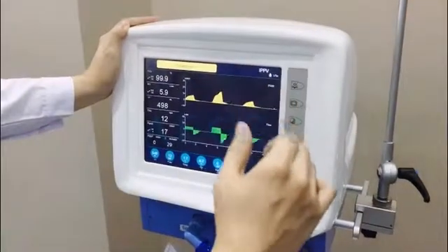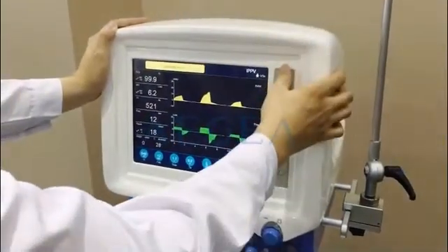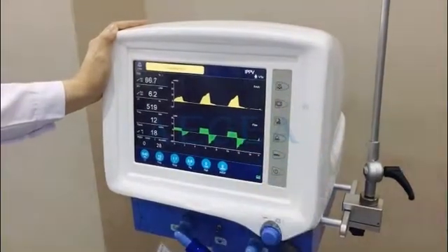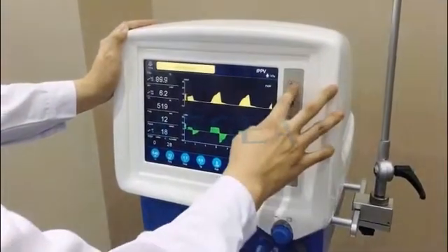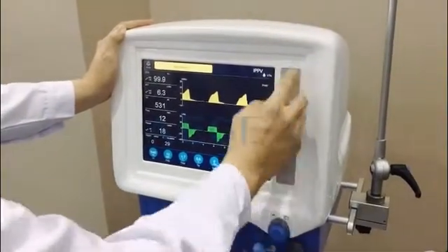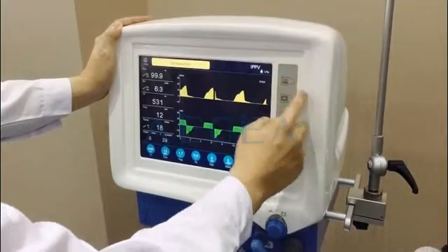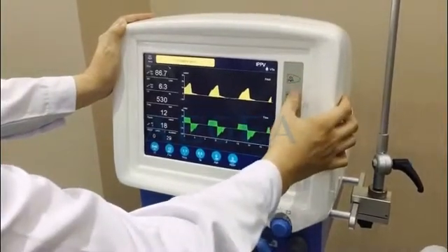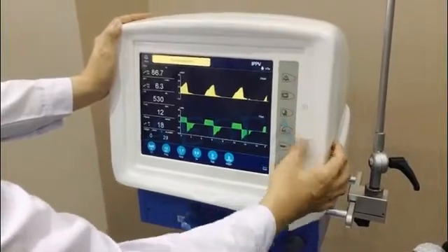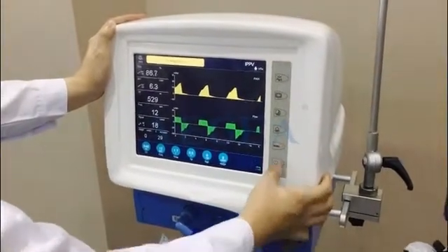You can hear the alarms. We can press this button to turn off the sounds — this is the mute key. And here is the controlling panel: mute key, system setting, machine setting, information, manual control, and standby key.